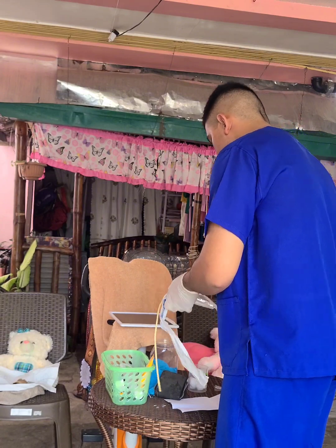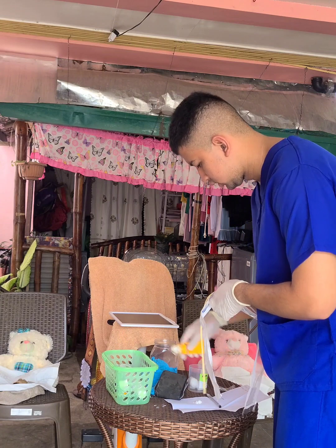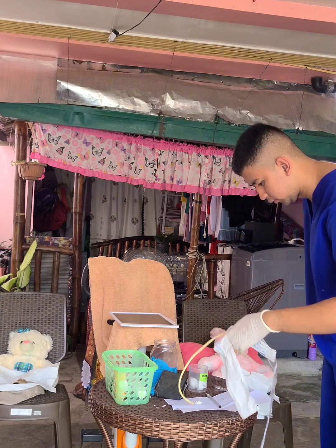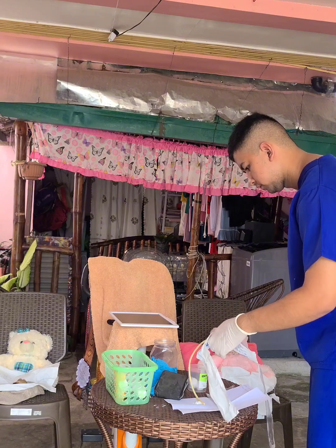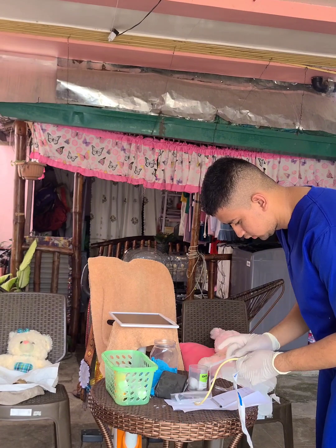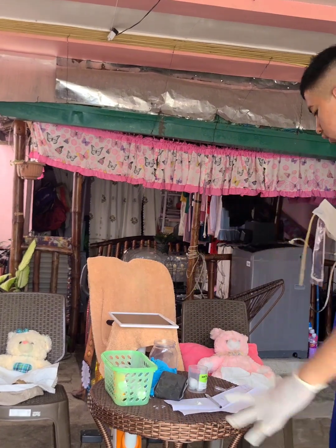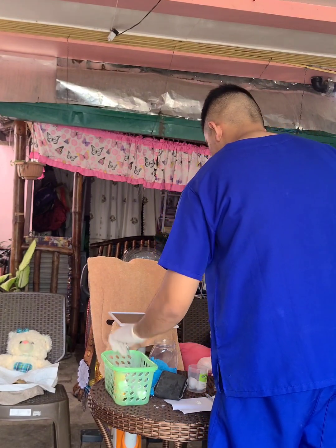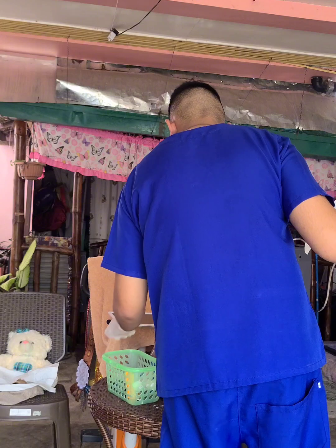And then we're going to lubricate the end part without touching it, of course. And then seal it again with a light touch. And then we're going to use our forceps to perform perineal care.